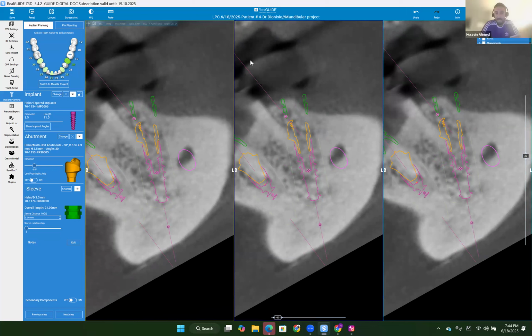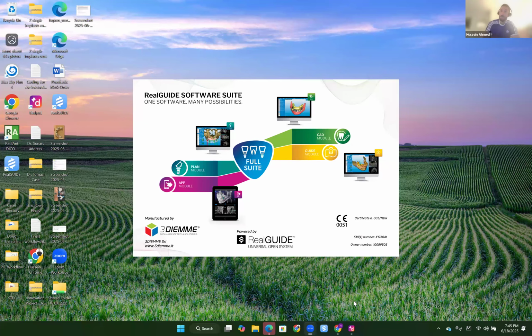Kwong is our next one, and there is no relevant medical history for the patient of Dr. Kwong, but one thing worth mentioning, Dr. Resnick, is that Dr. Kwong is planning on adding 2 implants, the first at number 2, an immediate implant placement site, and the second at number 4, which is a delayed implant placement, sir. Dr. Kwong, are you on the line with us?